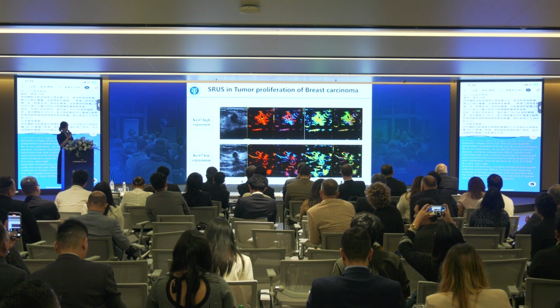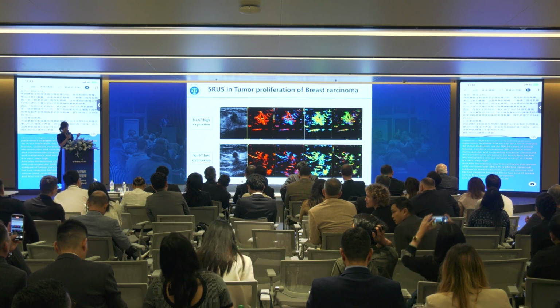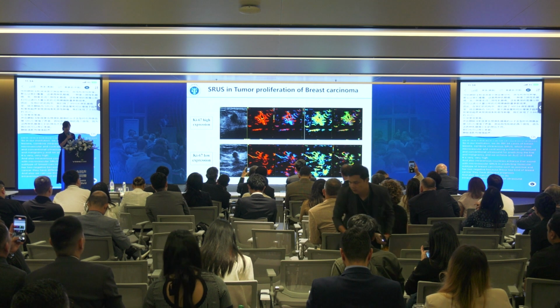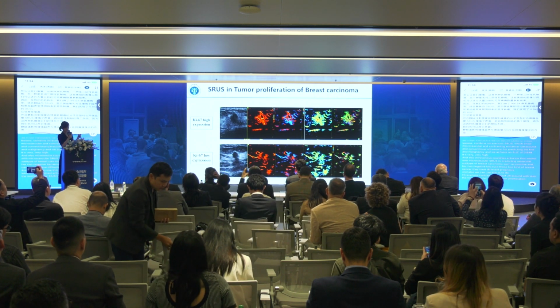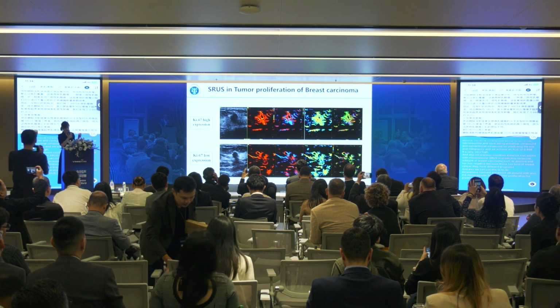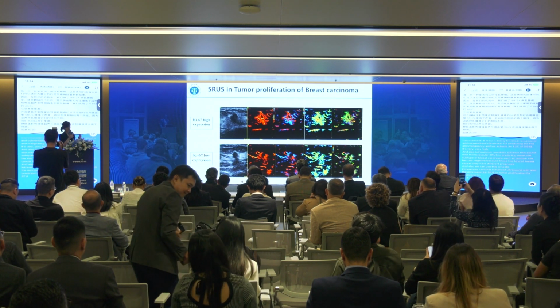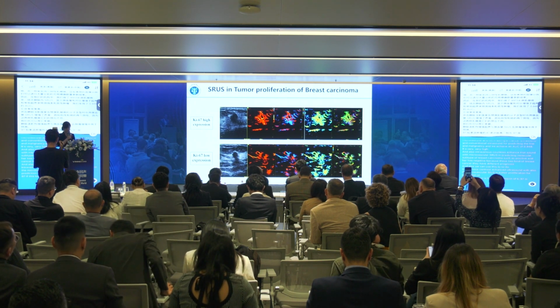And also, we can use intravenous contrast-enhanced ultrasound with microvascular SRUS in tumor proliferation for prediction of Ki-67, whether this tumor has a higher expression of Ki-67 or a lower expression.